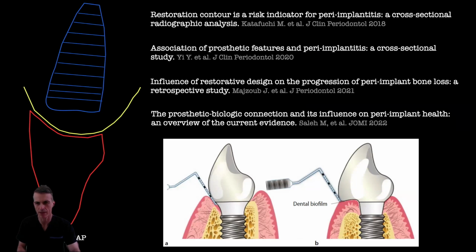There is plenty of research documentation showing the importance of the prosthetic design on the final outcome. A ridge lap will not even allow us to probe that implant.